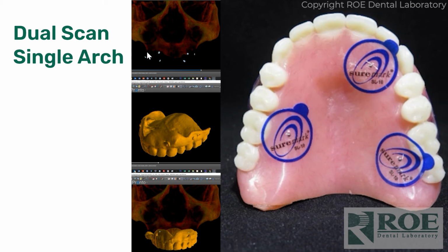This scan here is just simply showing that the markers are going to show up on this scan. Okay, you may not see the denture. That's okay. You'll see the markers. You'll see the patient. You know you've captured a dual scan. All right, just another image of where the markers are. There's actually 6 on this. There's just one here, one here, one here, and then 3 on the tongue side.